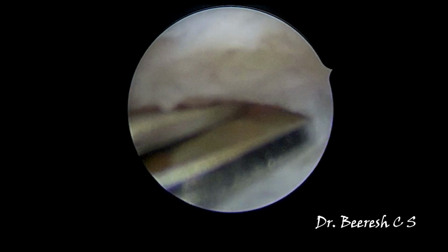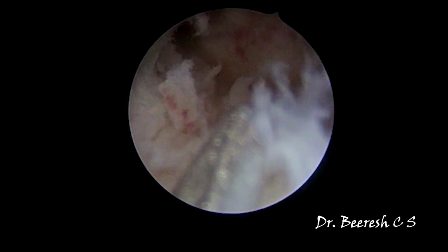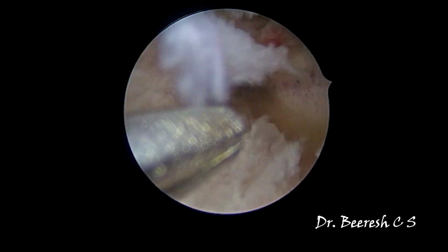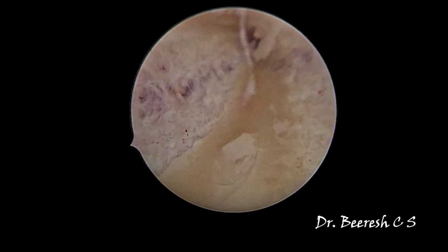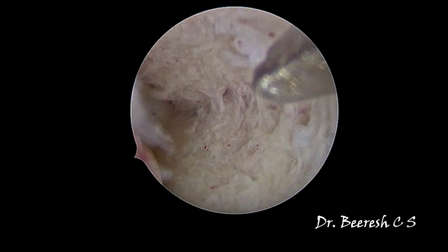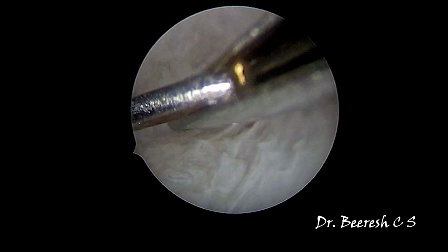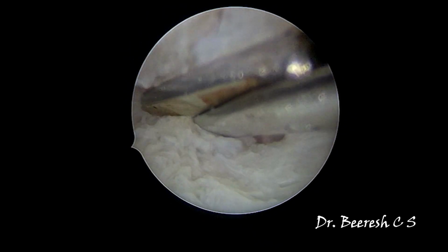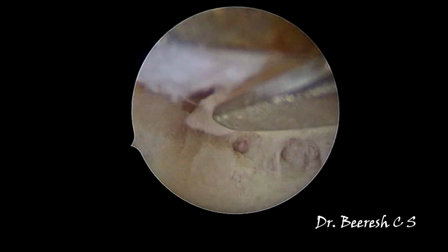This surgery can be done even using an energy source like a Collins knife as well, but I would prefer to do it with cold scissors so as to not damage the endometrium or the myometrium. There have been studies showing that whether you do it with a resectoscope or with cold scissors, the end results are the same.